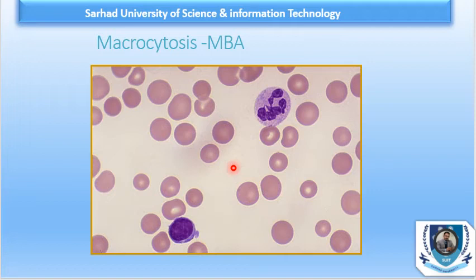So when you think about folate or vitamin B12 deficiency, you will not write or report that you have confirmed it as megaloblastic anemia or folate deficiency anemia, because you will go for further tests. For iron deficiency anemia you will go for iron profile, and for macrocytic anemias you must go for folate or vitamin B12 profile.